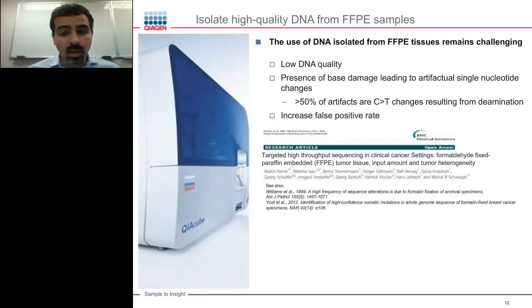This is one of them. It was published in BMC Medical Genomics. If you're interested in accessing it, it is freely available on the web, and it talks about the challenges of using FFPE samples.